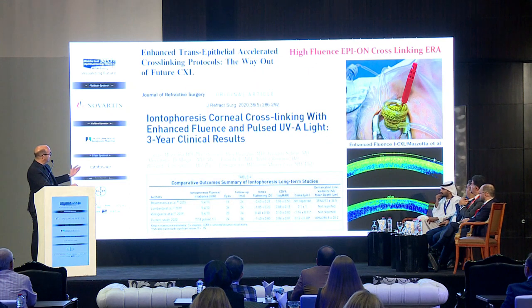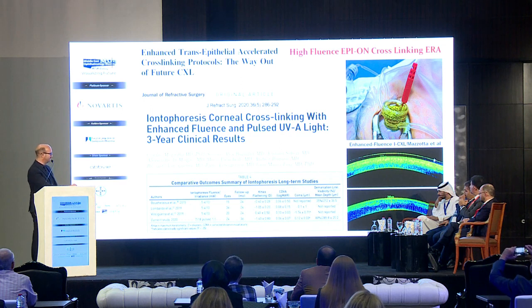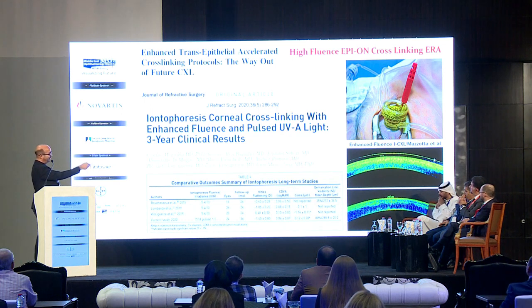These were the medium to long-term results published in the Journal of Refractive Surgery in 2020, showing that this new iontophoresis protocol, or Iontoplas, works. And you can see the demarcation line and the reflectivity of the stroma at OCT.